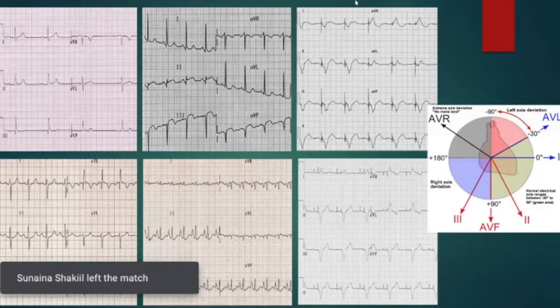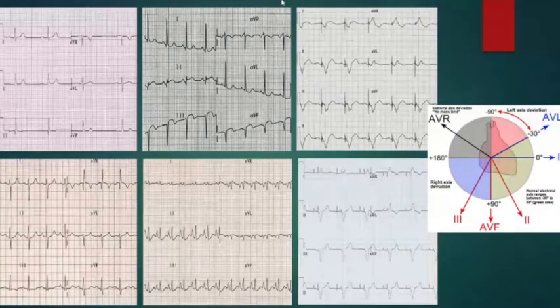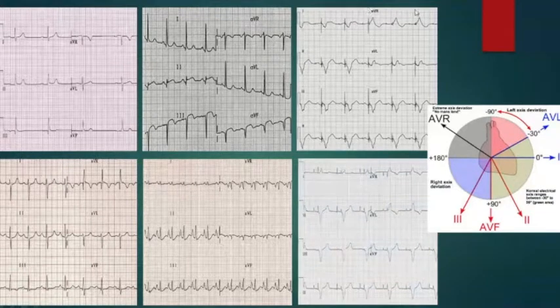VVI means there's one lead. Are they put in the left chambers or in the right chambers? The right side. Yes. When you put the pacemaker, you are bypassing the normal conduction system, and it's usually put in the apex or the lower septum. So usually you don't use the Purkinje fibers. The conduction is rather slow, so that's why you have widening of the QRS complex. The axis goes through the septum, then enters the Purkinje fibers and goes to the left, and then you have the extreme left axis deviation. The axis goes from down to up and to the left, so it's going here.